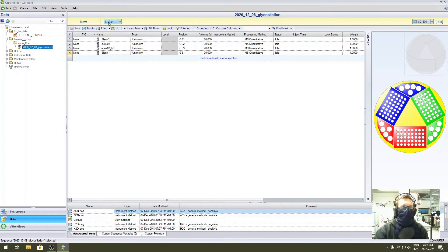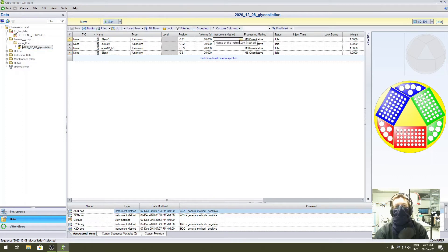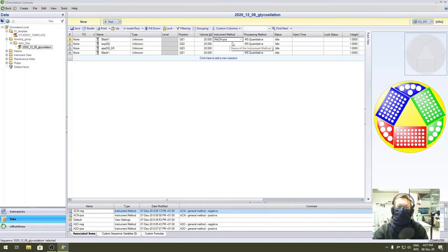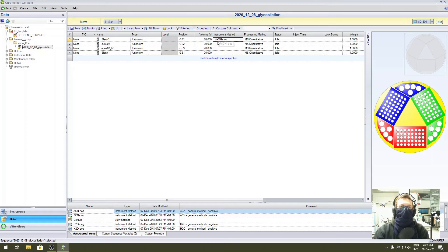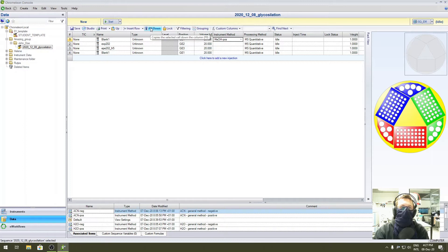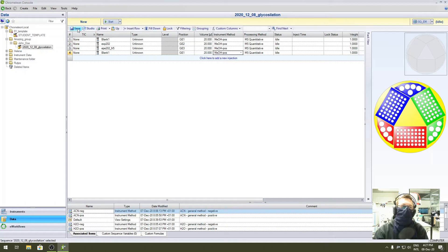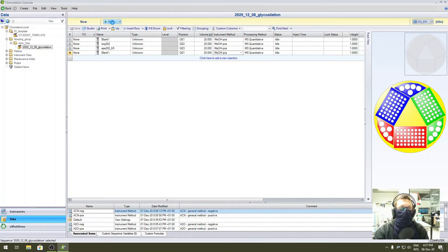Now it's time to submit. One last thing - you need to tell the machine what to do. For instance, we want to measure in methanol in positive mode. Then apply it for all injections - you can either click fill down or hit the button F9. Before you click start, it's always good practice to save your changes first. Then click start.